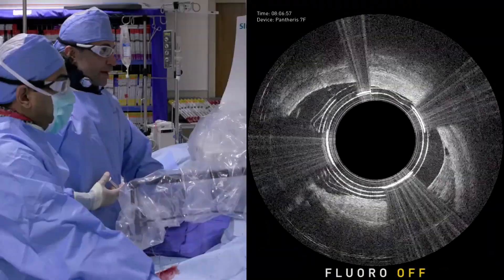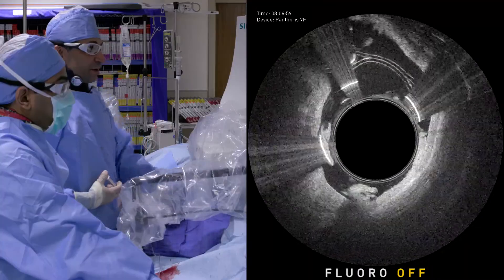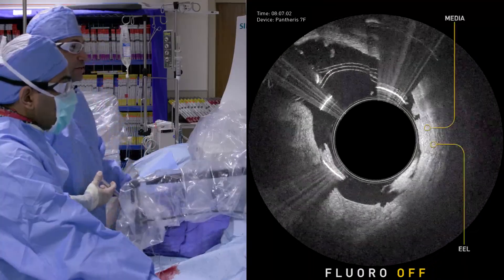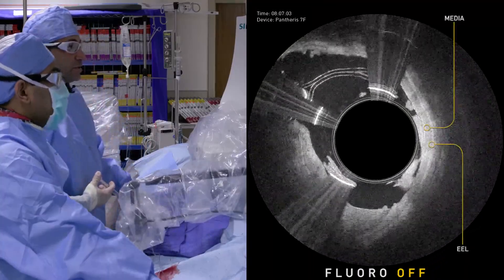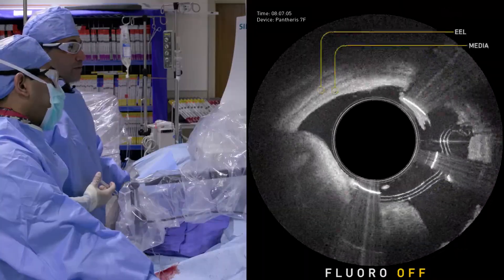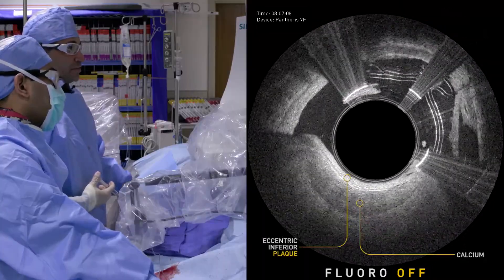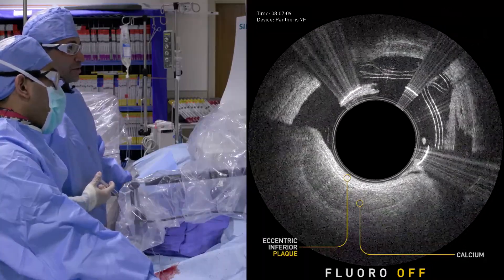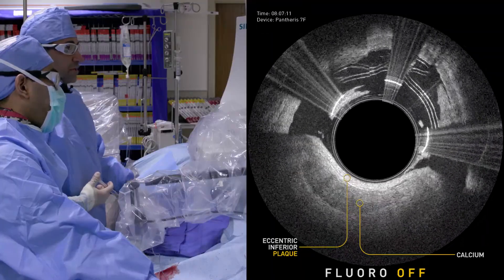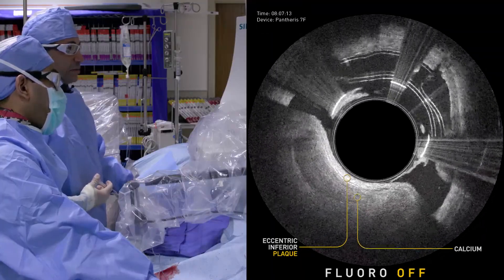So now I'm going to open it back up. Identify where I'm going to be. That is looking straight into the medial wall. I'm going to go away from that. Identify my plaque. You see some calcium there too — it's a really nice shot of that. And I'm going to inflate my balloon.